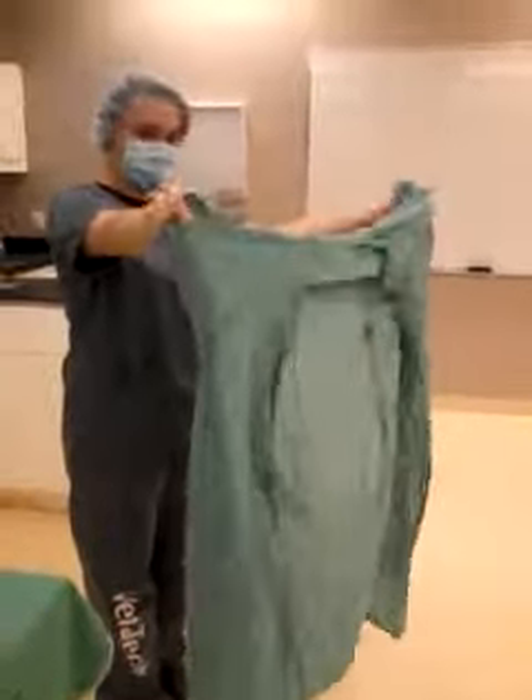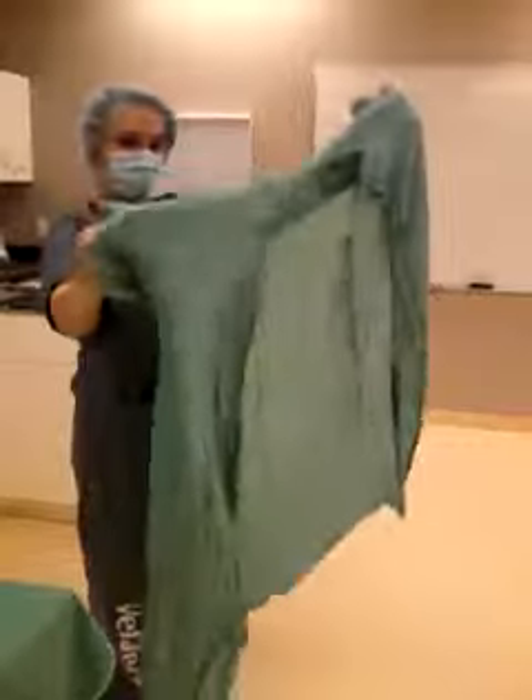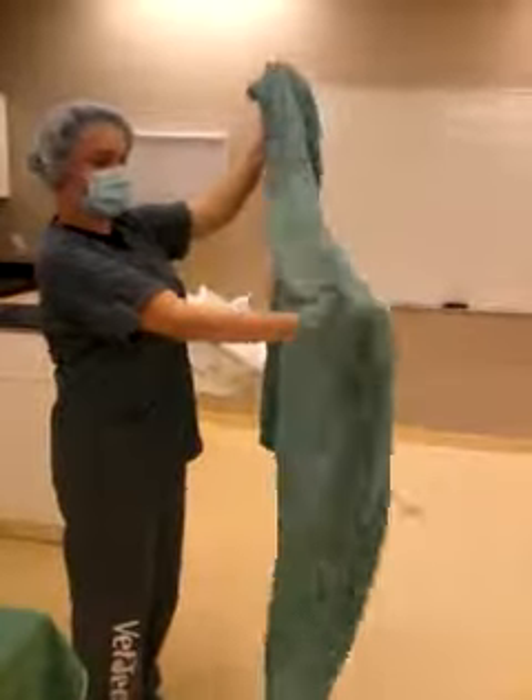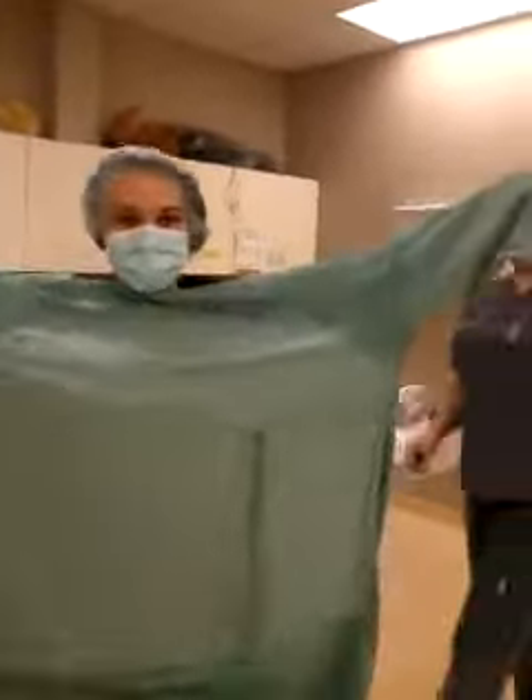Then I'm going to slip my hands inside like so, which is very hard. And then I'm going to get a circulating nurse to come behind me and tie it up.